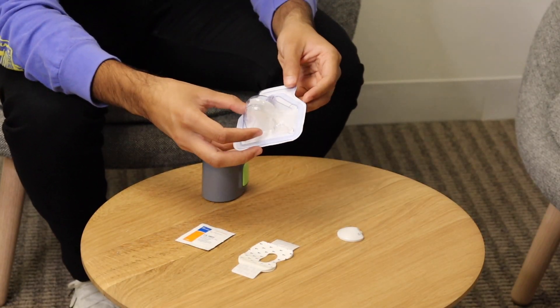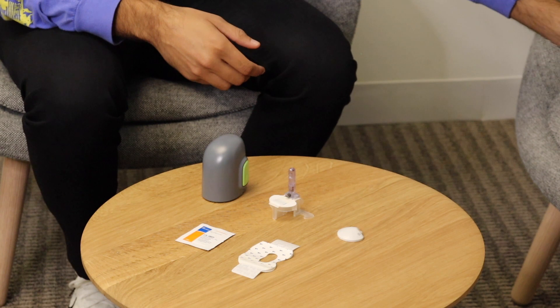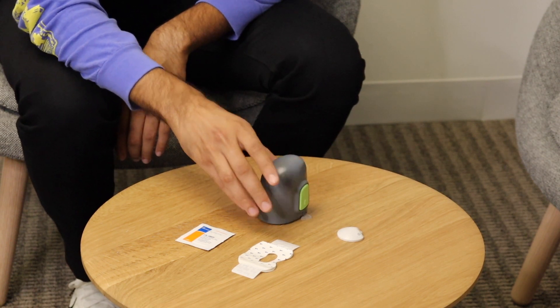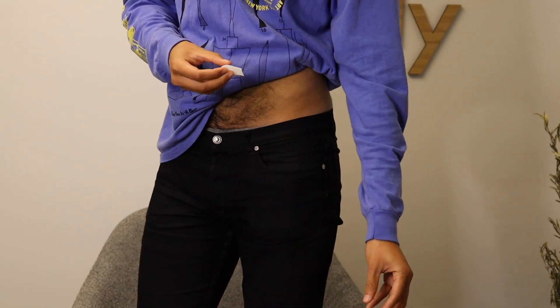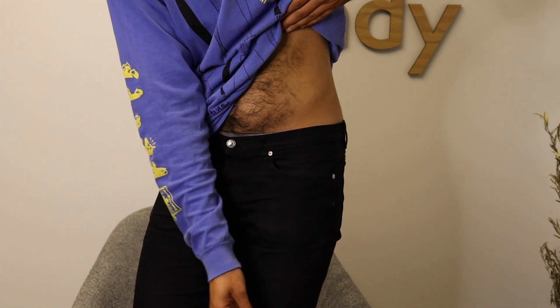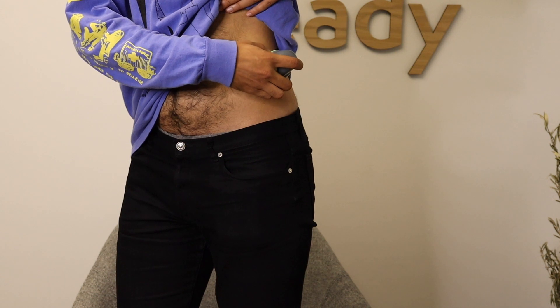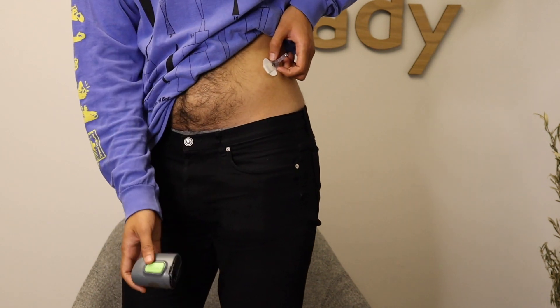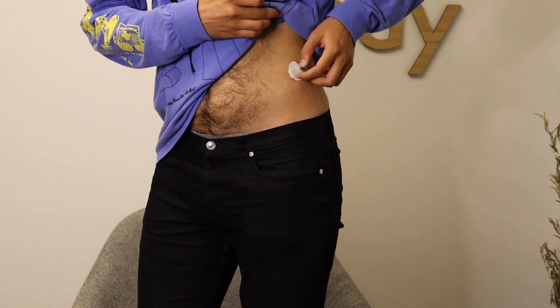The first step is to take the sensor out of the packaging and place it on the table. Then take the inserter and connect it to the actual sensor. Next, select a site, then take the inserter and place it over the site and install the sensor. Just hold it in place, then take out the top plastic piece and settle the bandage in.